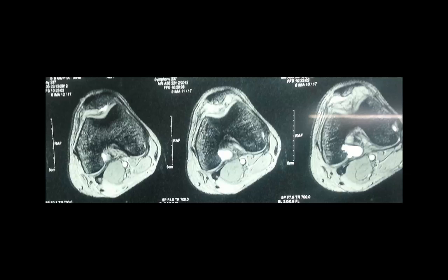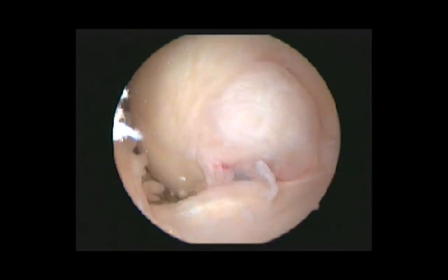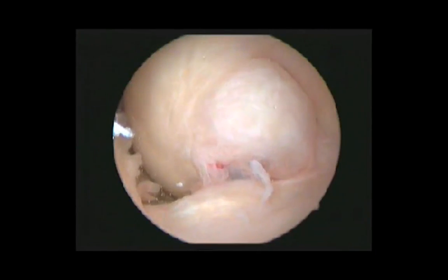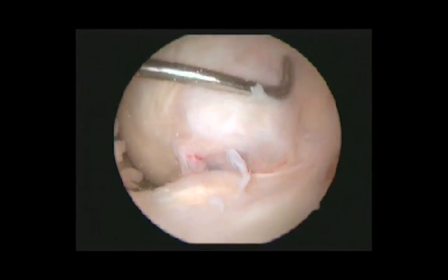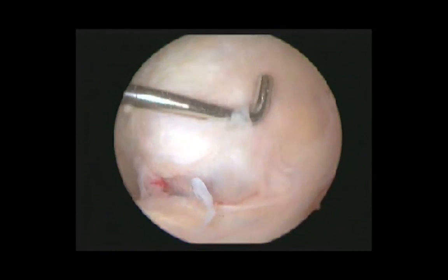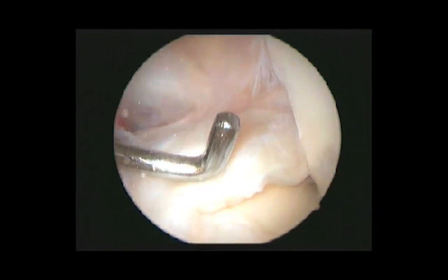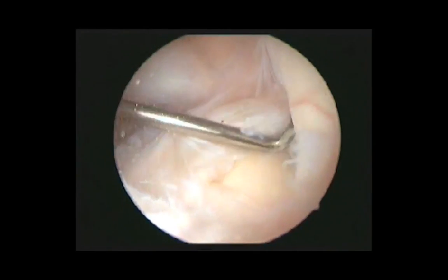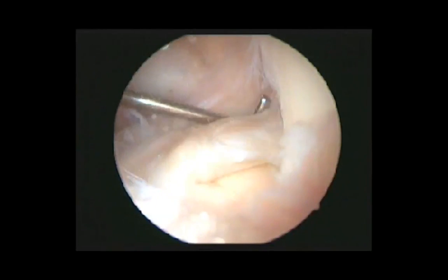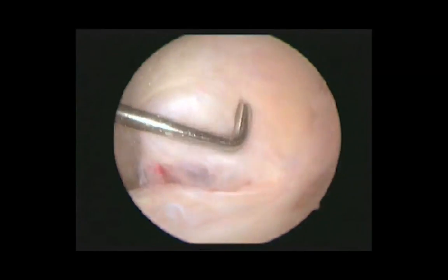It extends into the intercondylar notch, leaving an impression extending up to the tibial plateau, as noticed in these images. In the arthroscopic view, the cyst is extending into the intercondylar notch. A thin bluish membrane can be noticed in the inferior aspect of the cyst, and this is the ACL that has been pushed laterally because the cyst is occupying most of the intercondylar notch.